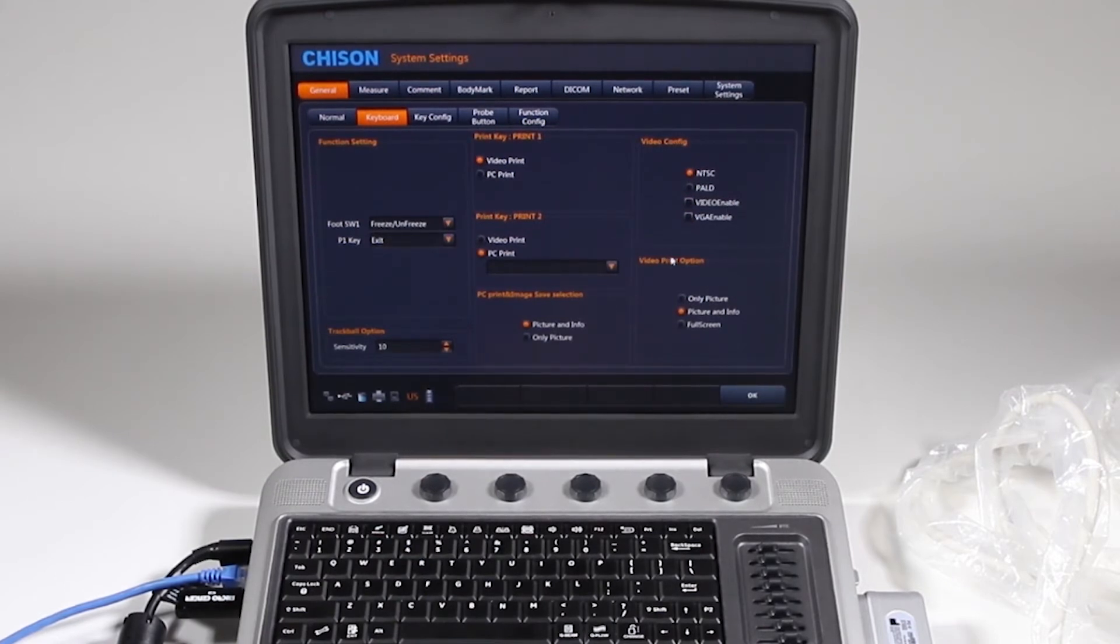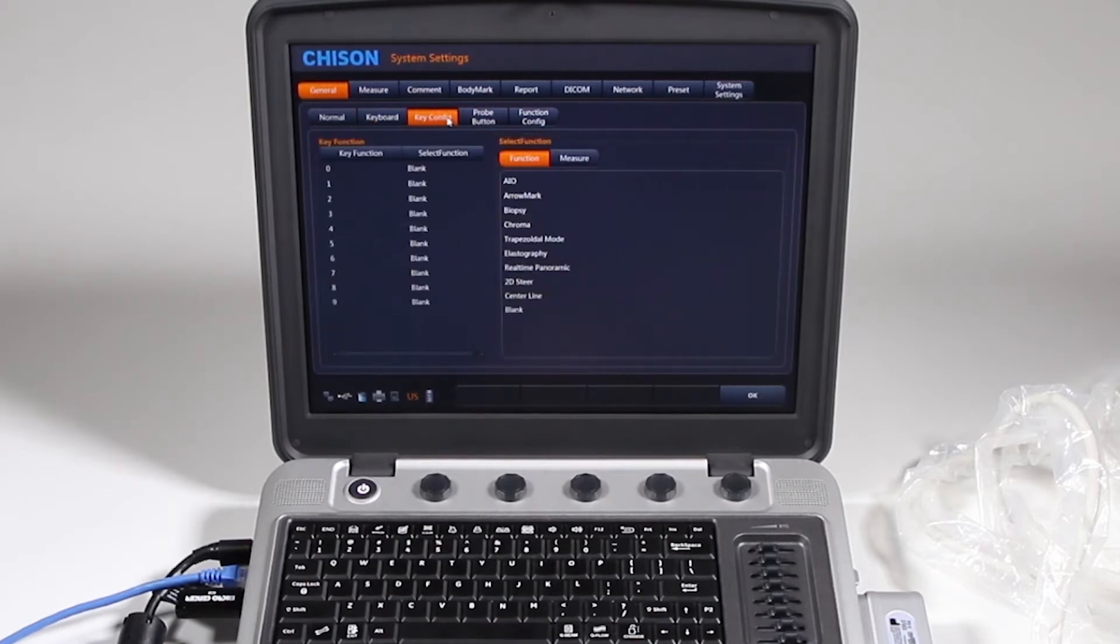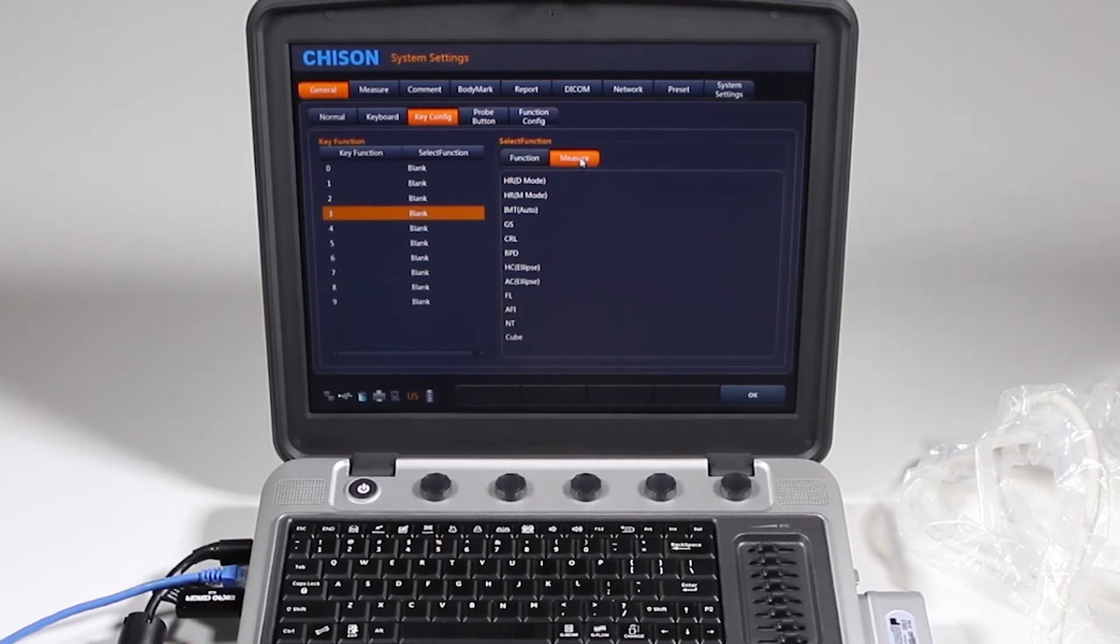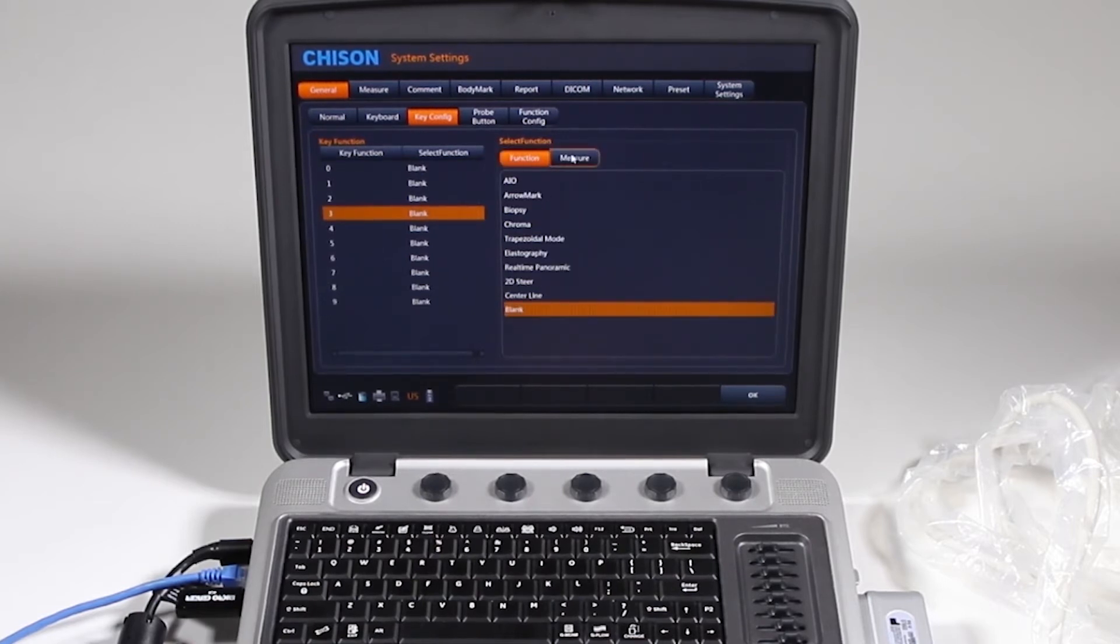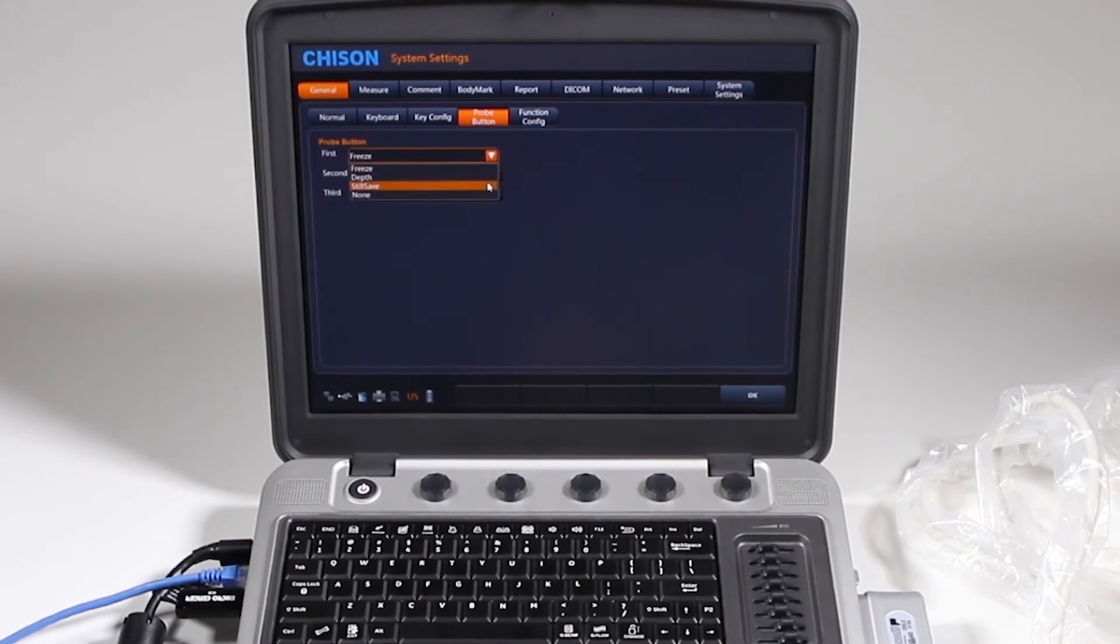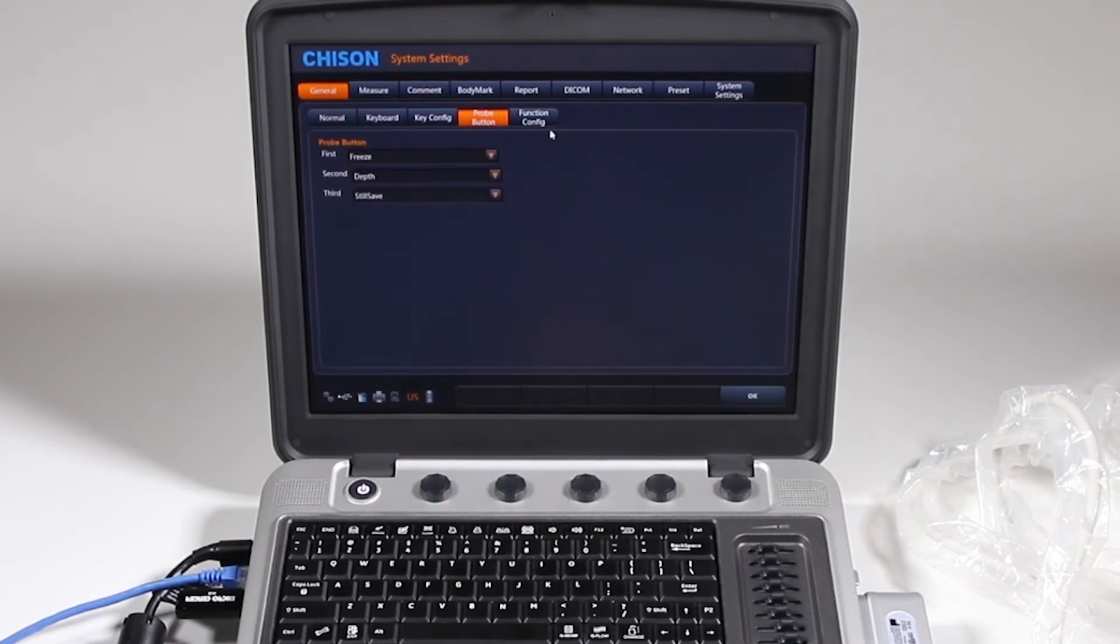Same thing with the video print, how much information do you want on there? Key configuration for your function keys, you can have it set up for various functions when you press that button, either function or measurement. Probe button, this is specifically for the three button probe. If you want it to freeze, depth, or still save while you're doing the scanning.